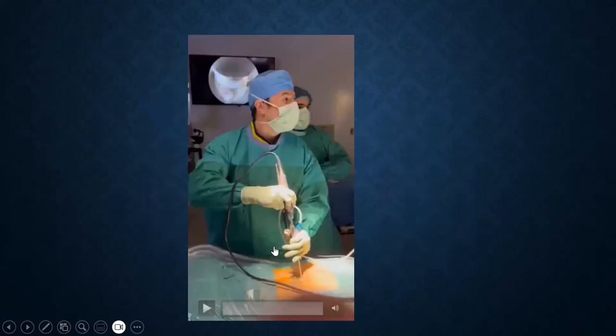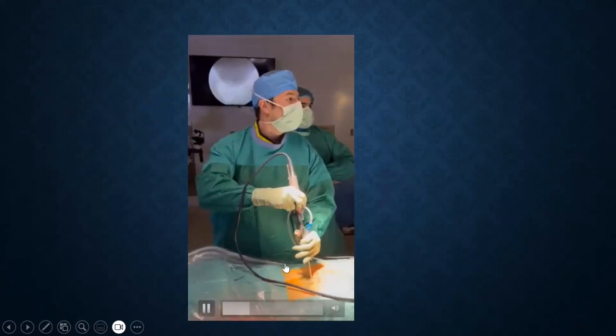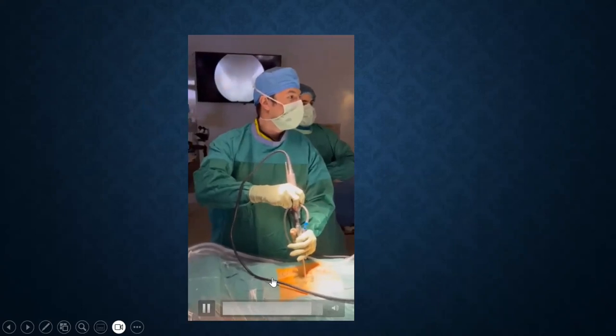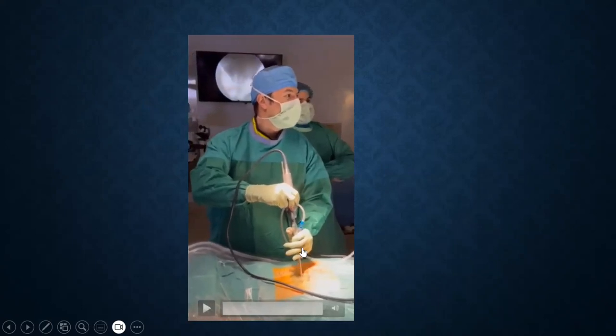And this is just an example of what it looks like when you're holding the endoscope. This is a video of the chief resident doing an interlaminar case. Your left hand is maneuvering the working channel and the scope, and your right hand is going in and out with whatever you're using. In this case, it's a drill, and you see there are screens all around the room. So it's a very ergonomic type of procedure once you get comfortable doing it. I just wanted to show the setup for people that haven't seen this before. But again, this is the interlaminar approach, not transforaminal, like what we do for a thoracic disc.